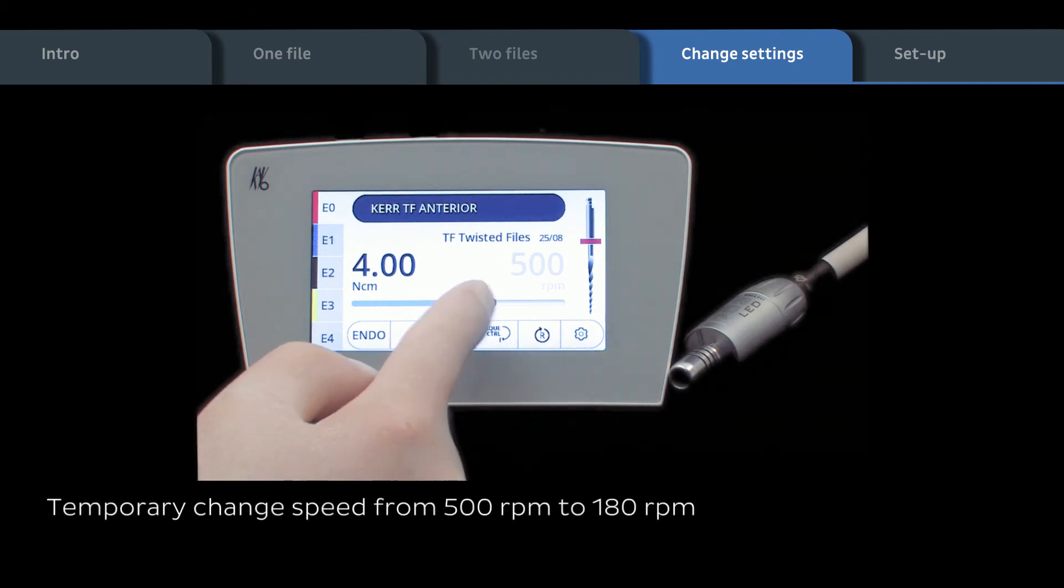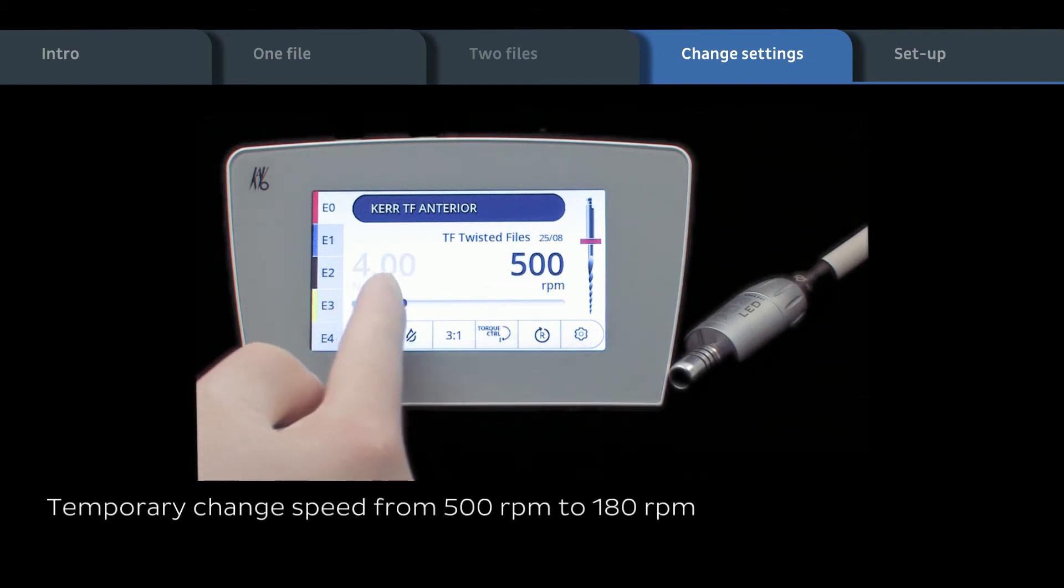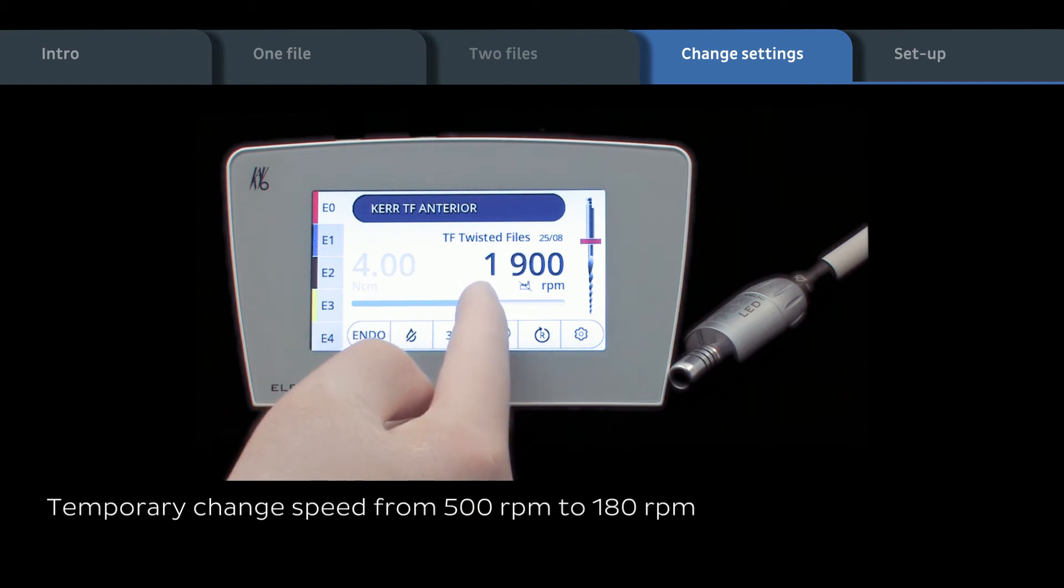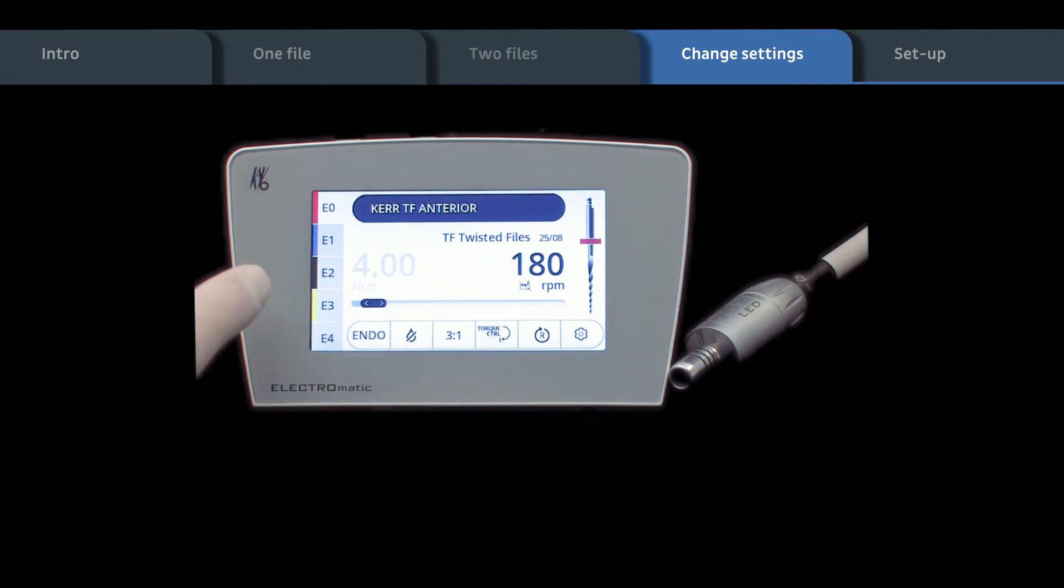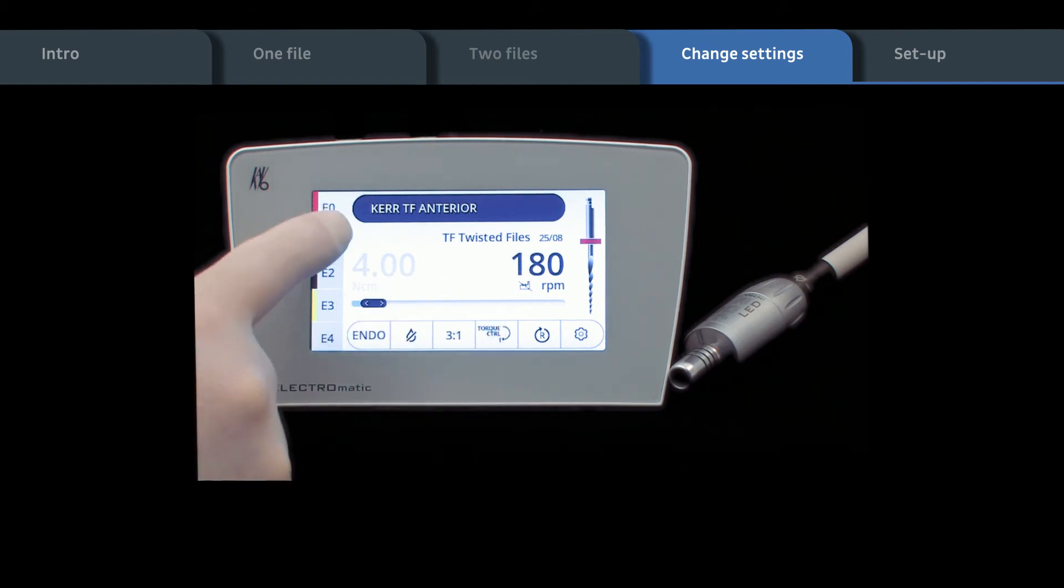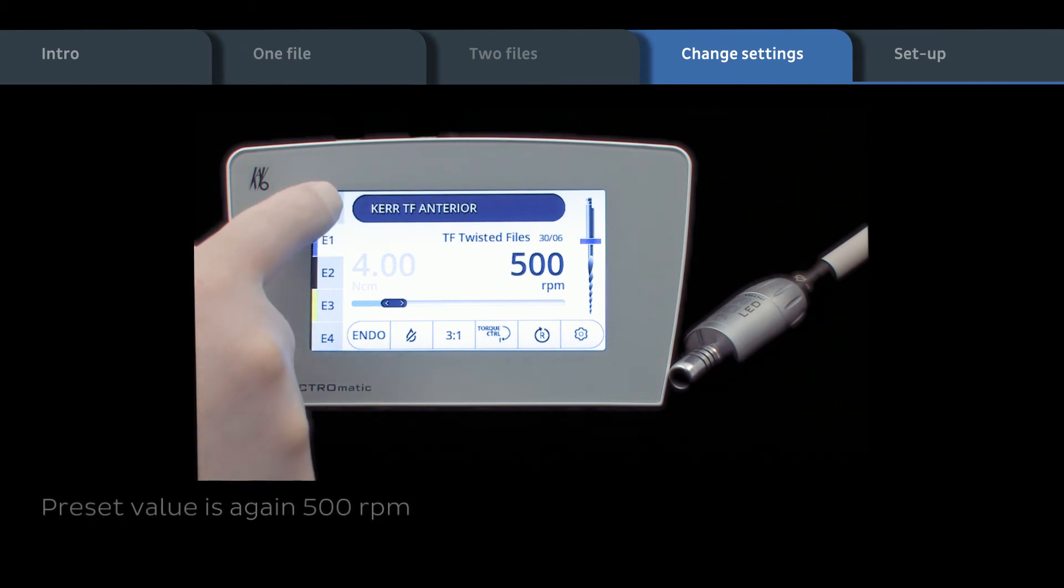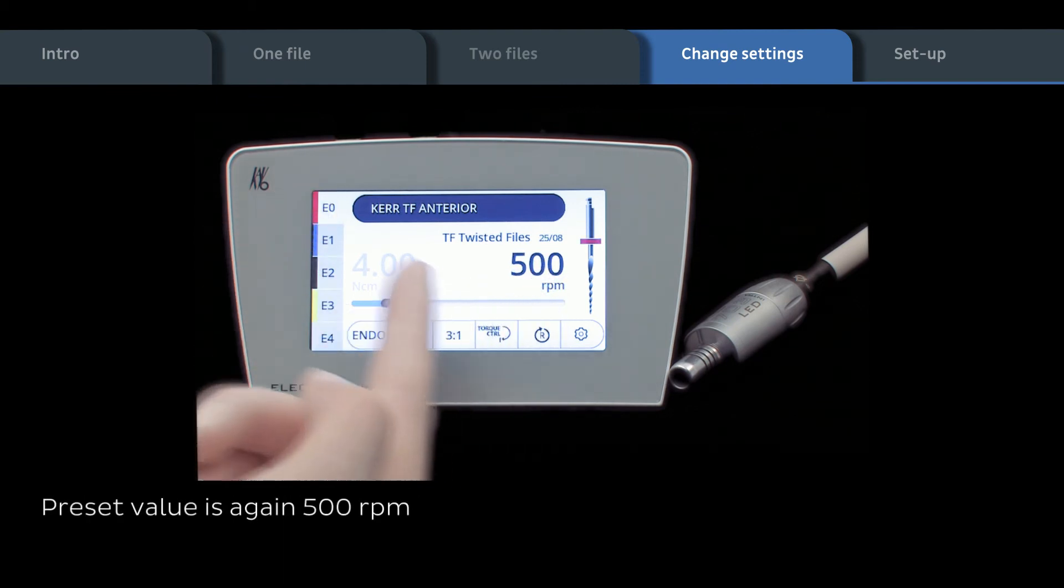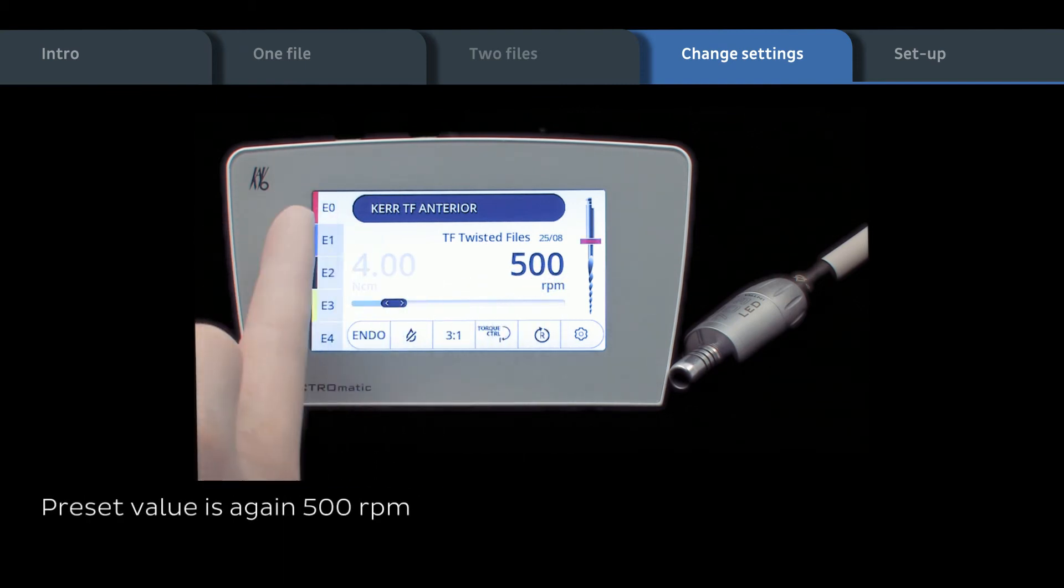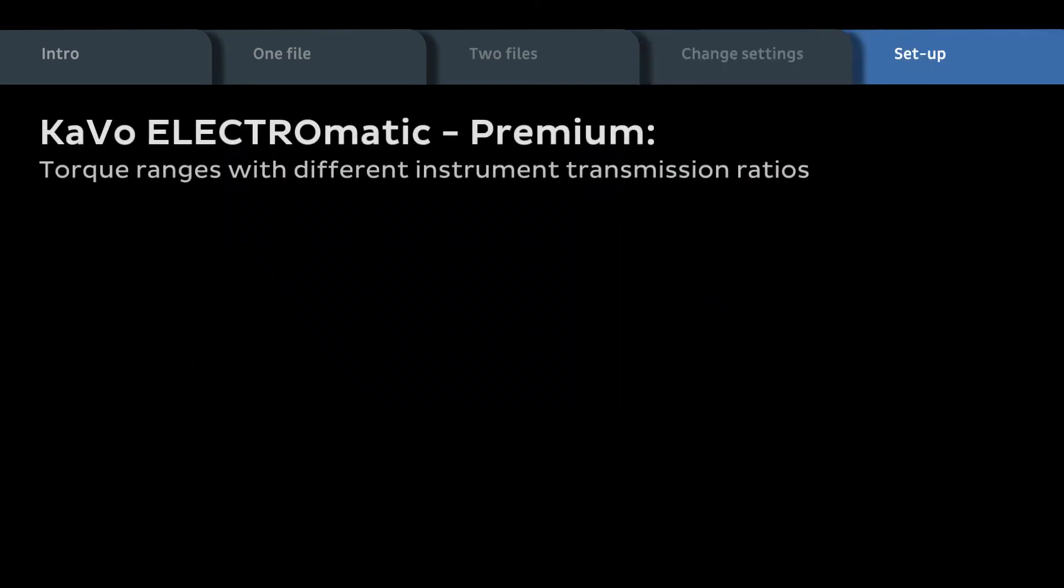First of all, change speed temporarily from preset 500 RPM to 180 RPM. You can now work with 180 RPM. Switch to another file and go back. You see that the preset value is again 500 RPM.